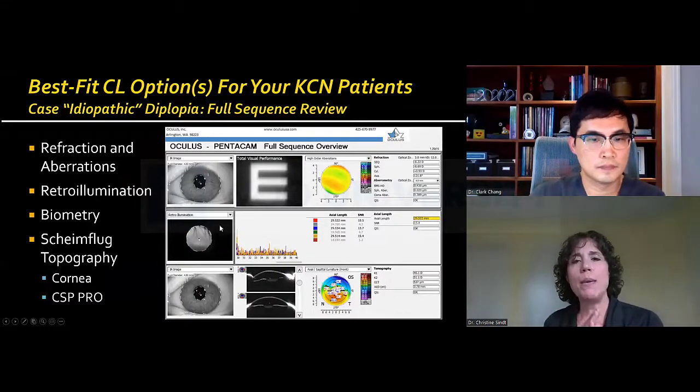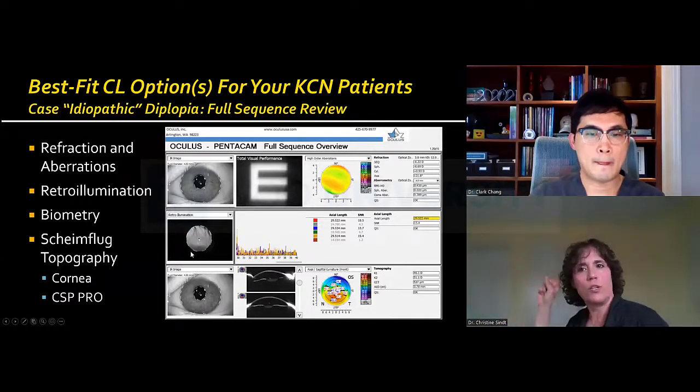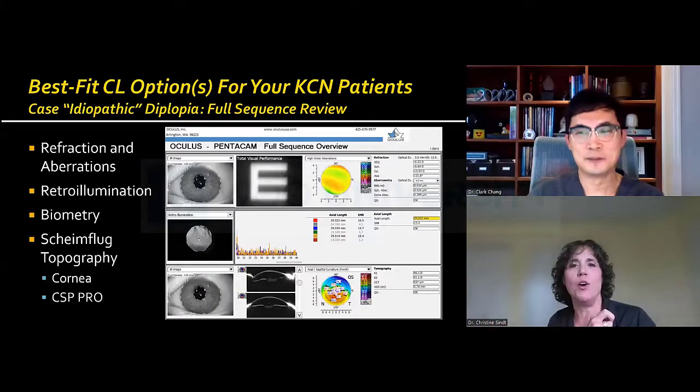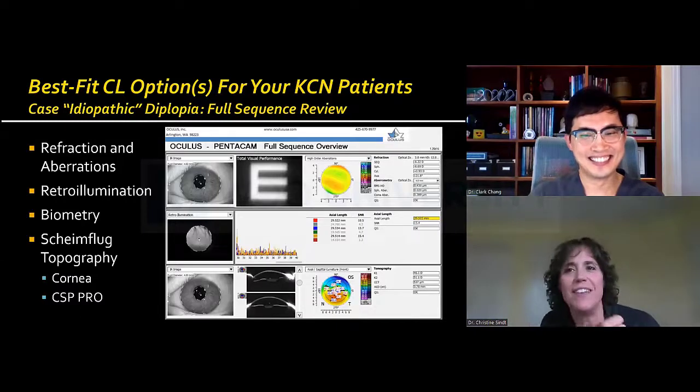And so I recommend that you do retinoscopy in the complete dark, get their pupil as big as you can, and then just come in there really quickly with your retinoscope and know where that cone is. The pupil will shrink down as soon as you put the retinoscope there, but real fast, get in there and see where it is.